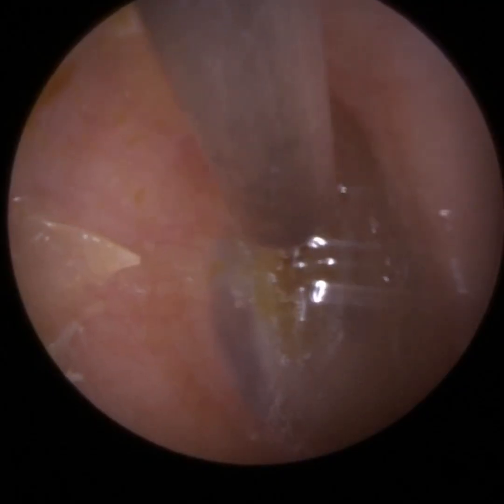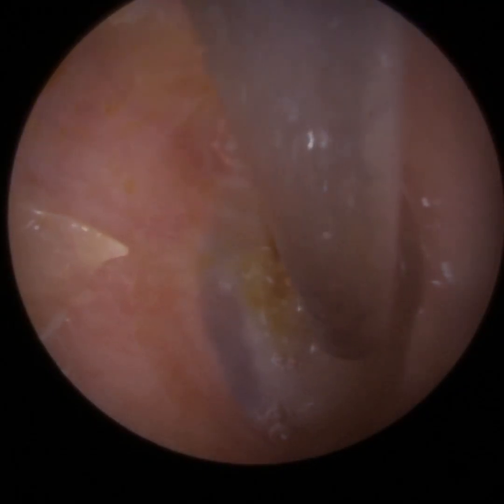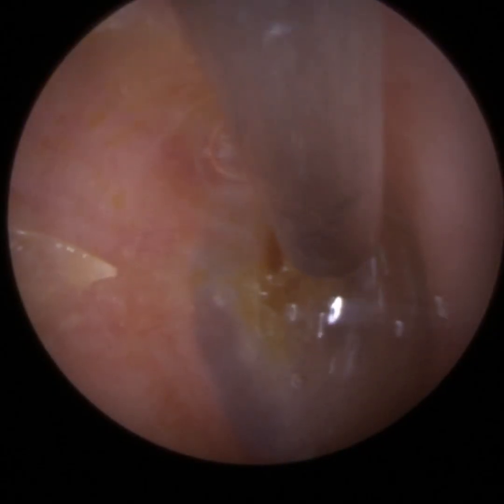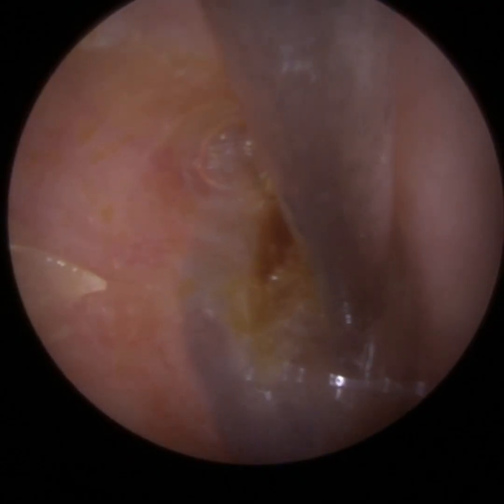So I've just put some more sodium bicarbonate drops in because this skin is extremely adhered to the eardrum. And I'm just, again, suctioning the excess oil first. So I got most of the skin out. There was a bit left on the handle of malleus, so the hammer bone, the first bone of the 3 ossicles.